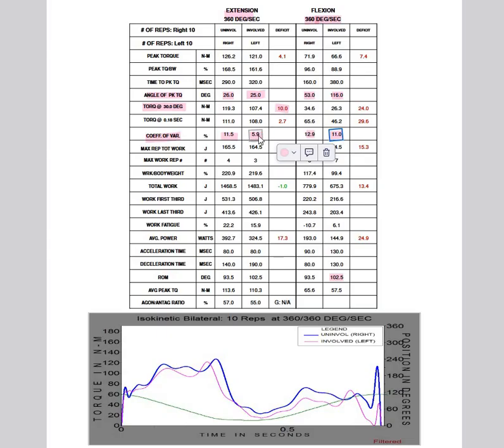There are other factors that can influence this. The more repetitions you perform, obviously the greater the variation you're going to get between those repetitions. So if you're performing a fatiguing protocol where you have 20 plus repetitions being performed, then your coefficient of variance is going to potentially be higher. Pain, discomfort, injury are all factors that are going to influence this, and this is information you will get from your participant at the beginning.